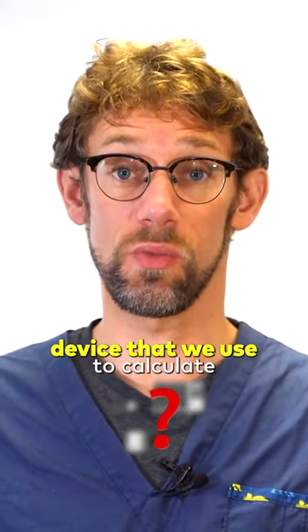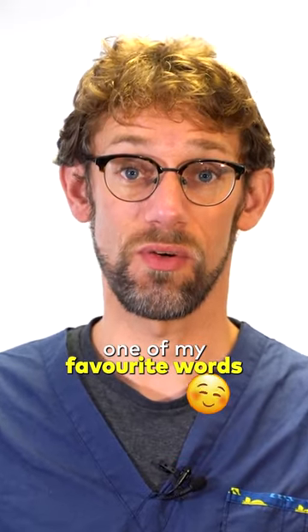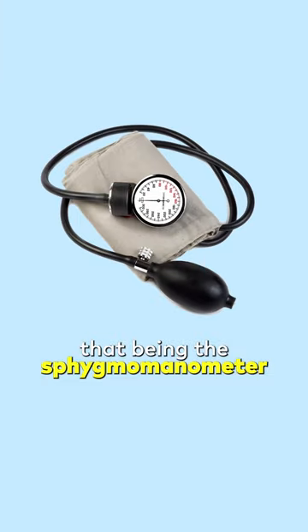The actual name for the device that we use to calculate a patient's blood pressure is one of my favorite words, that being the sphygmomanometer.